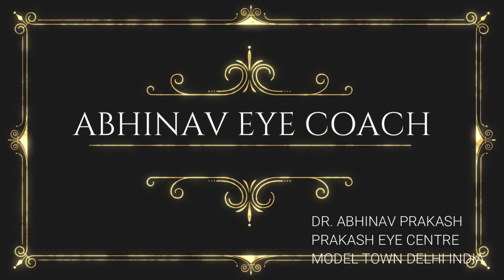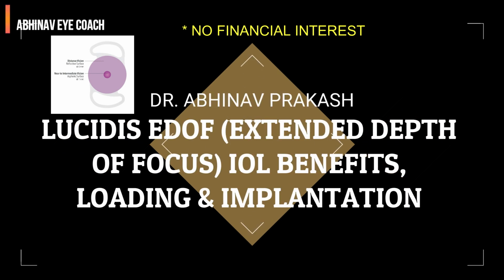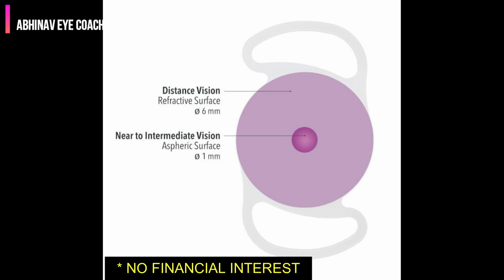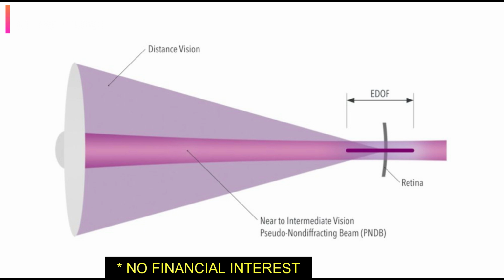Today I am going to tell you some details about the Lucidis extended depth of focus lens, its benefits, loading technique and implantation. It provides very good near and distance vision as well as intermediate vision. So there are two zones, center is for intermediate and outer zone is for distance vision.